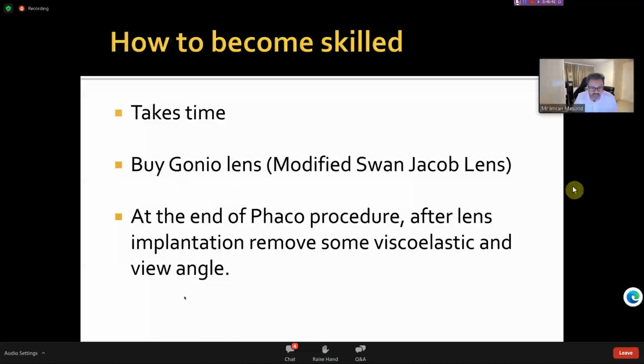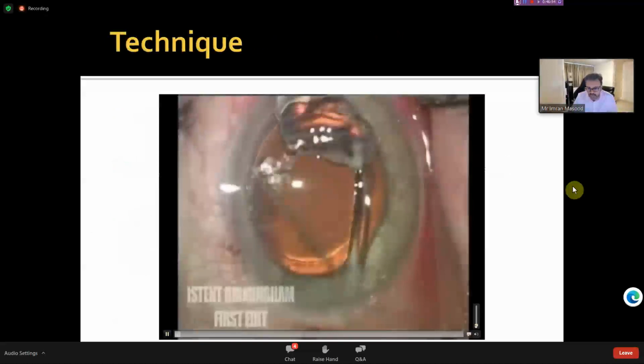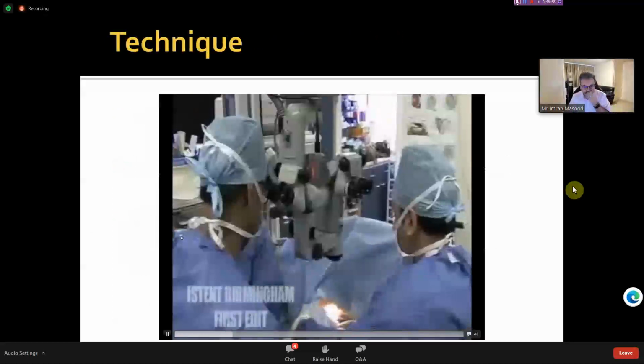Turn the patient's head 40 degrees and then tilt your microscope by about 30 degrees and pop your gonio lens on and just get a view of the angle. This is a video I was part of a number of years ago, where we did a live iStent masterclass. This is me doing live surgery.